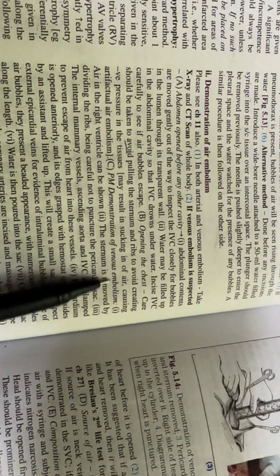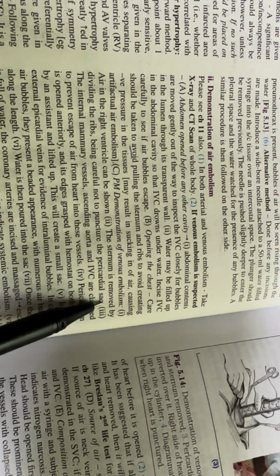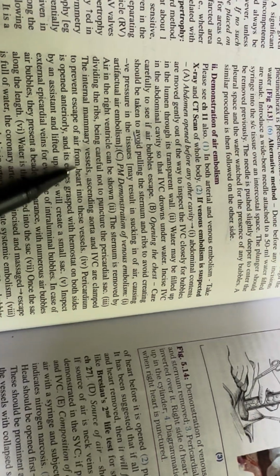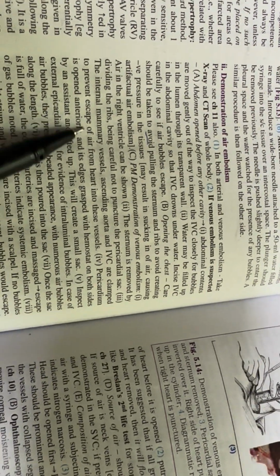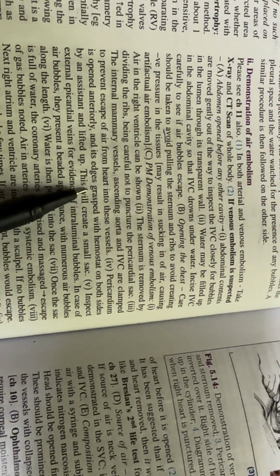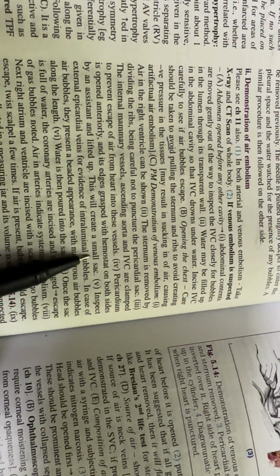Postmortem demonstration of venous embolism. Air in the right ventricle can be shown. The sternum is removed by dividing the ribs, being careful not to puncture the pericardial sac. The internal mammary vessels, ascending aorta and inferior vena cava are clamped to prevent escape of air from the heart into these vessels. The pericardium is opened anteriorly and its edges grasped with a hemostat on either side by an assistant and lifted up. This will create a small sac.